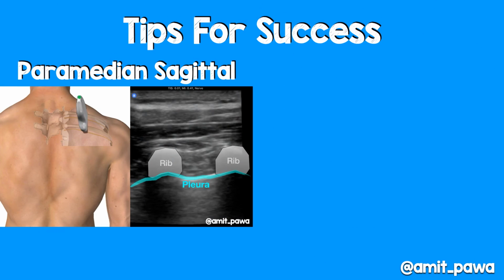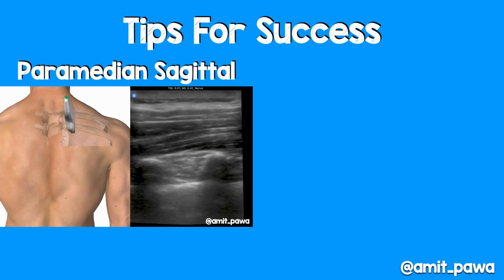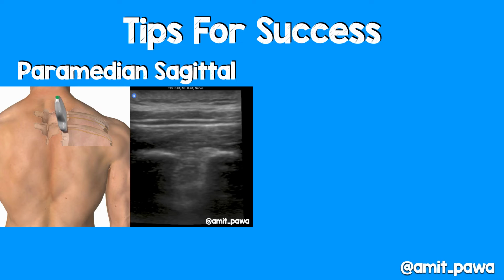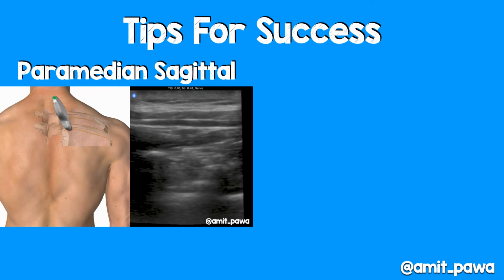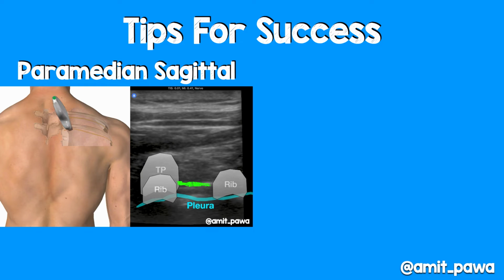So what are my tips for success? Well, let's start off here with the probe in a paramedian sagittal orientation, far away over the ribs. So I know that the bones that I'm looking at are the ribs, and I know deep to the ribs I see the pleura. And then slide from lateral towards the midline, and you see the ribs go deeper and they get replaced by these rectangular shaped transverse processes. With a slight bit of tilt, you can then begin to appreciate the pleura deep to them, and then see the green line there, which is the superior costotransverse ligament.